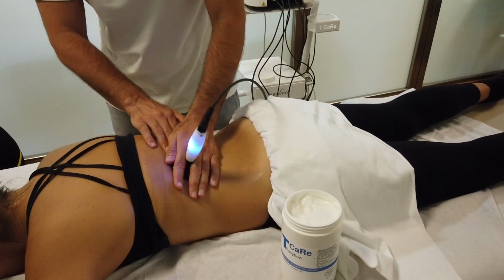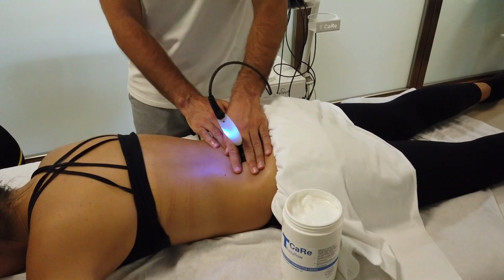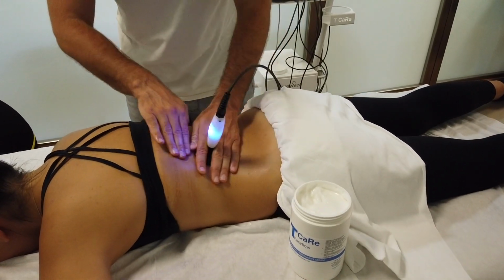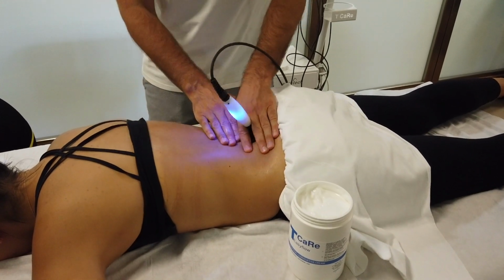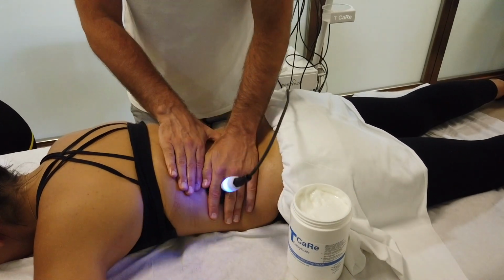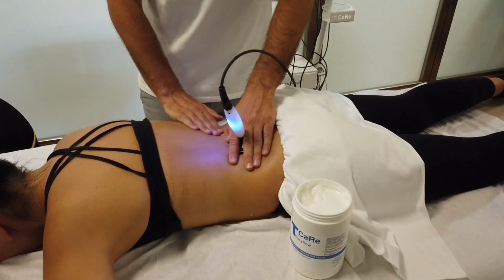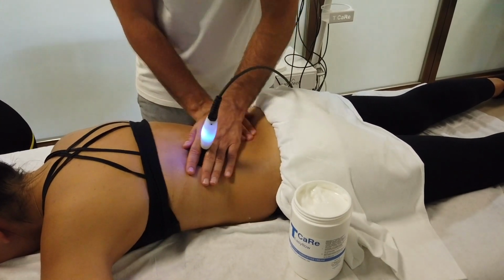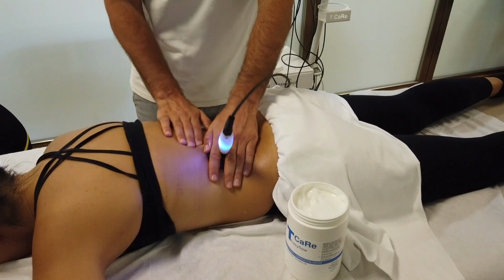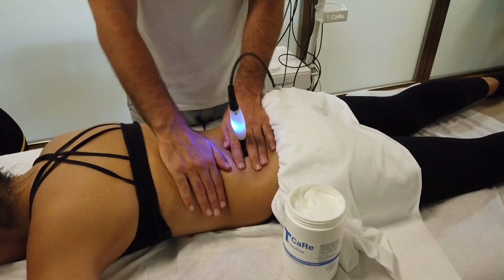For example, in a herniated disc case, lower powers are used, and it also treats the nerve course in the lower limb. But now in this specific case, in lower back pain, I work with capacitive in the muscle tissues, and the target is to improve the temperature of the tissues. And in this modality I combine manual therapy with TCARE treatment.